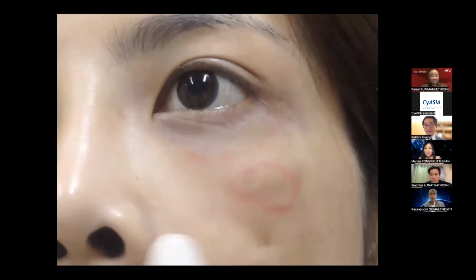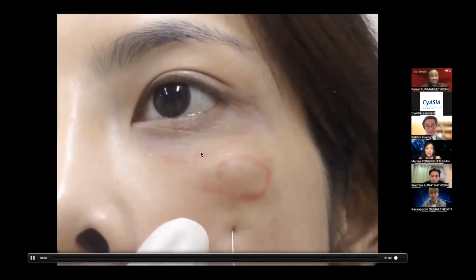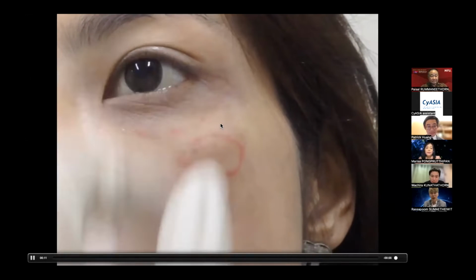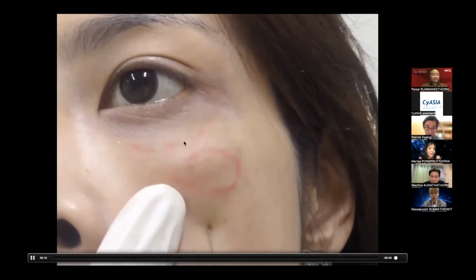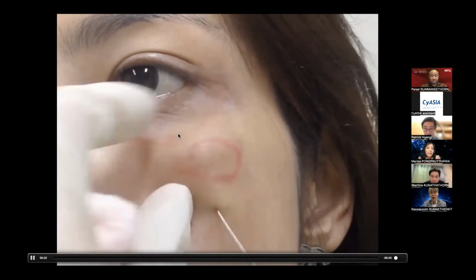Okay, so when you treat the second floor, I mean that you treat the orbit and also the orbicularis retaining ligament with the softer filler. You create a structure around the orbit from the lateral to the medial, but do not inject or put the tip of the needle above the orbicularis retaining ligament or the orbit.